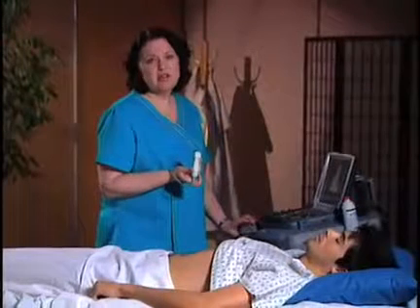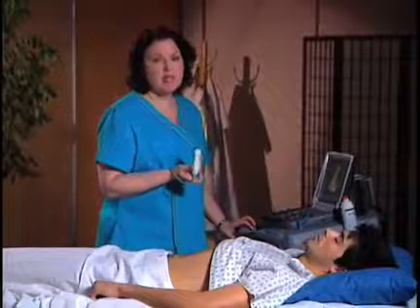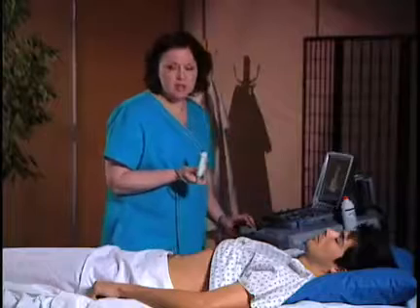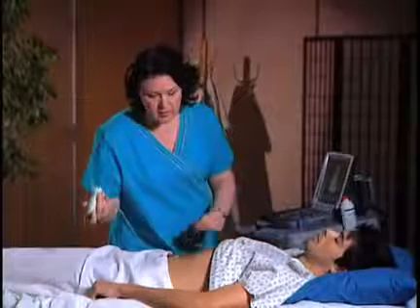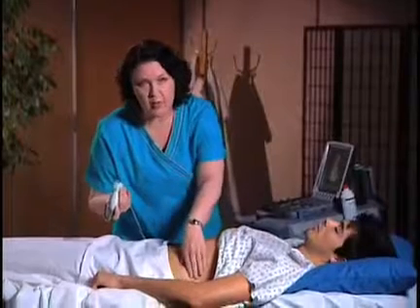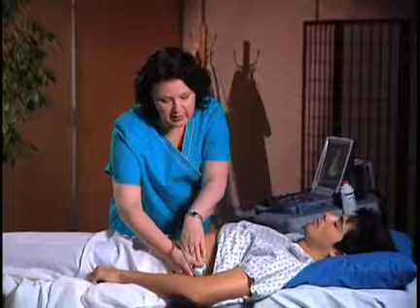An important part of a kidney evaluation is a bilateral comparison between the right and left kidney to determine if there's hydronephrosis present on one side versus the other. So we'll go ahead and do the left side as well. An easy landmark here is just to identify the costal margin and then move up one hand's width and bring your transducer in at the mid-axillary line.